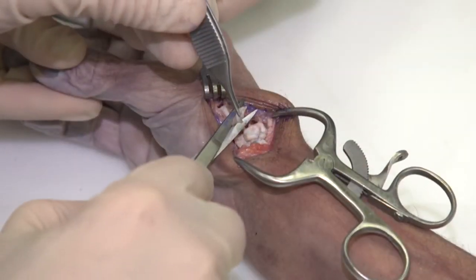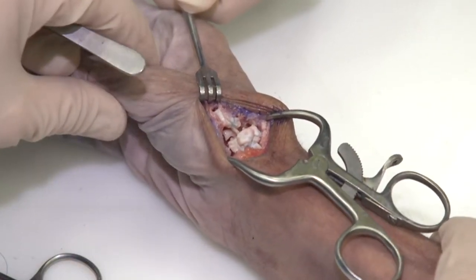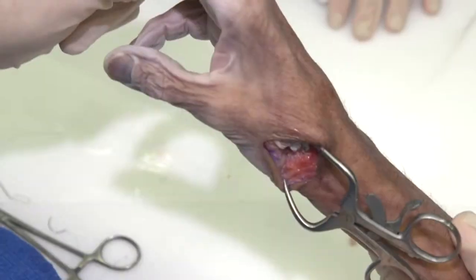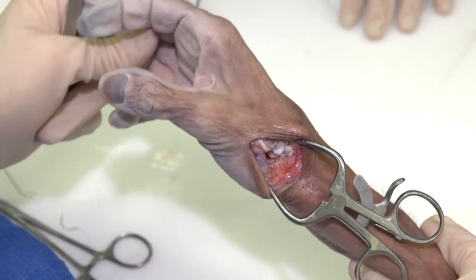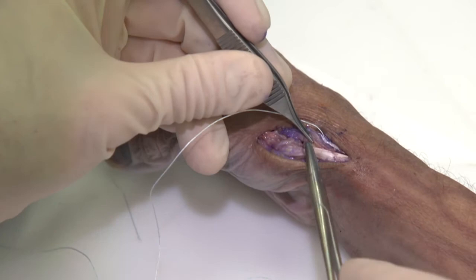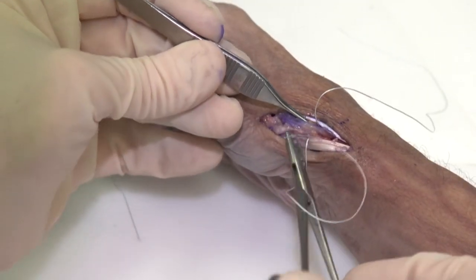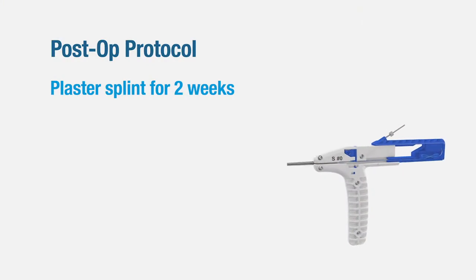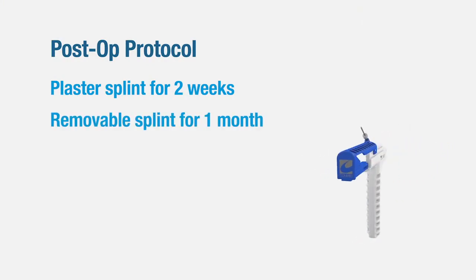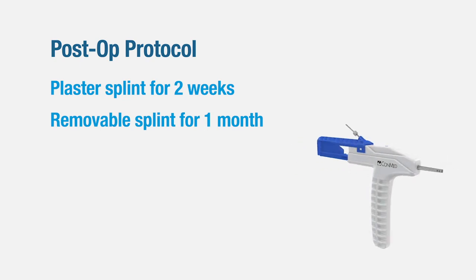At this stage I simply excise excess tendon and the reconstruction is complete. You can see the interposition in good position. The thumb has a very nice abduction vector, and at this point we complete the procedure by imbricating the capsule. Skin closure with 4-0 nylon. Post-op protocol is a plaster splint for two weeks and then a removable splint for one month that the patient can remove to shower. Thank you.